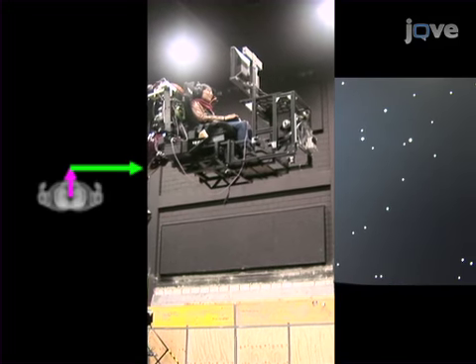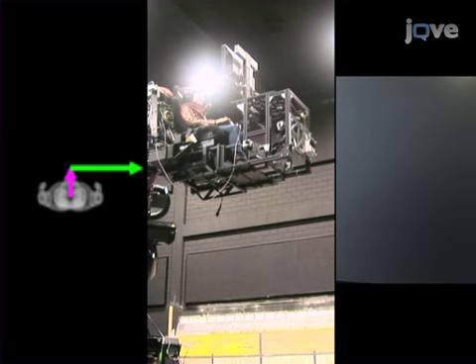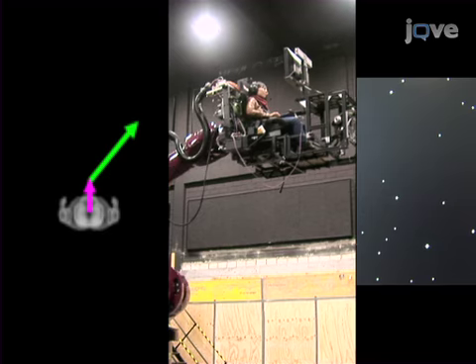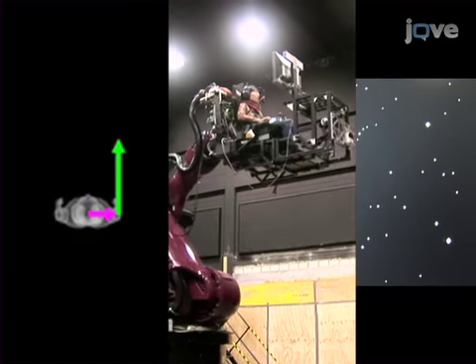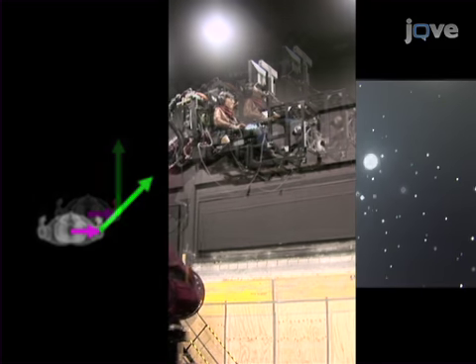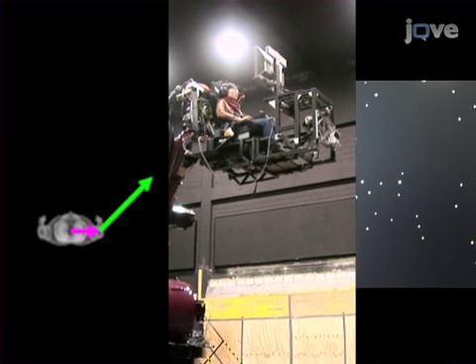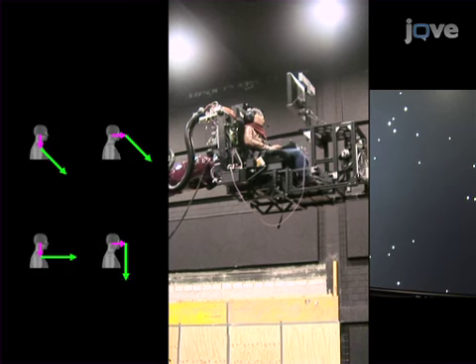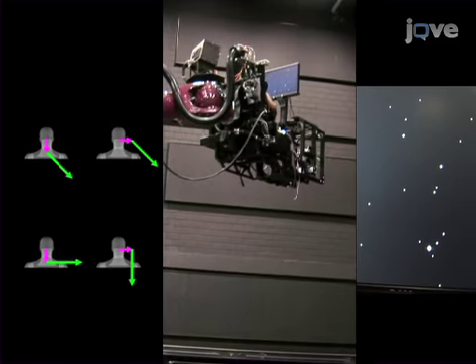For example, movement in the horizontal plane consists of either forward-rightward movement through 90 degrees, forward-rightward movement through 45 degrees, rightward-forward movement through 90 degrees, or rightward-forward movement through 45 degrees. These types of movements are also performed in the sagittal and frontal planes.